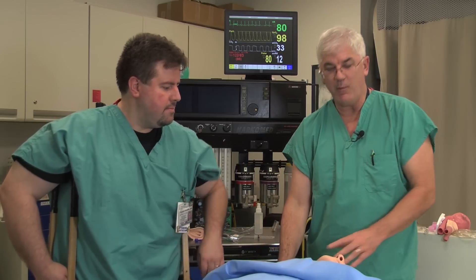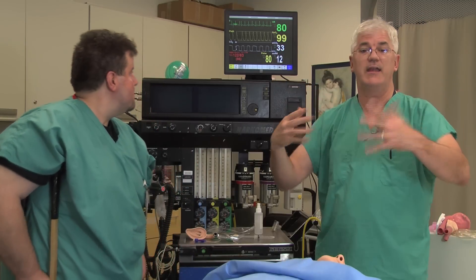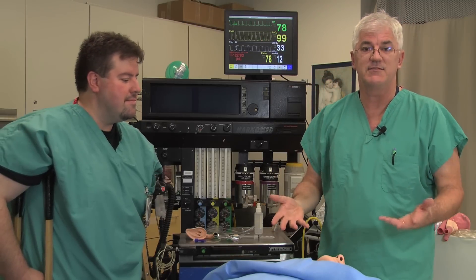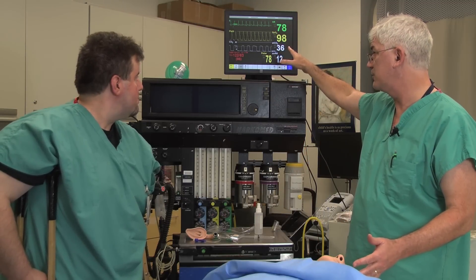Suction is one of the things that we're likely to forget, but so, so important. Necessary for visualization should the airway become filled with fluids — helps us to get control over that. Once we have all the equipment, we want to make sure that the patient is adequately monitored. You might have to go flying into a room, but most of the time in an ICU, the person is already monitored and you're going to at least have a pulse oximeter and an EKG. In an invasive setting, you might have an art line too, so you can send off blood gases.